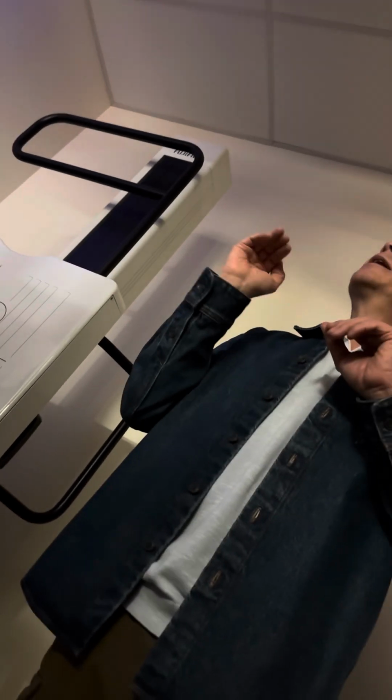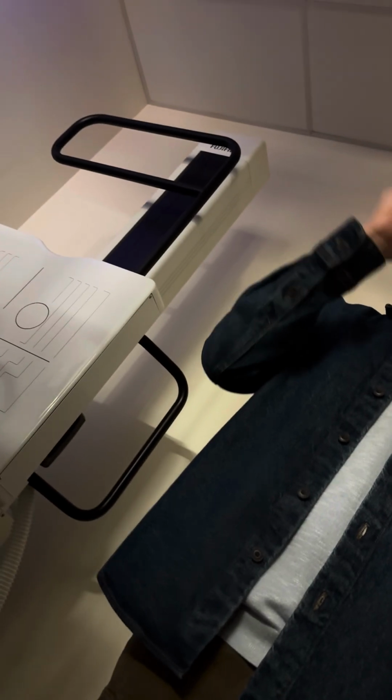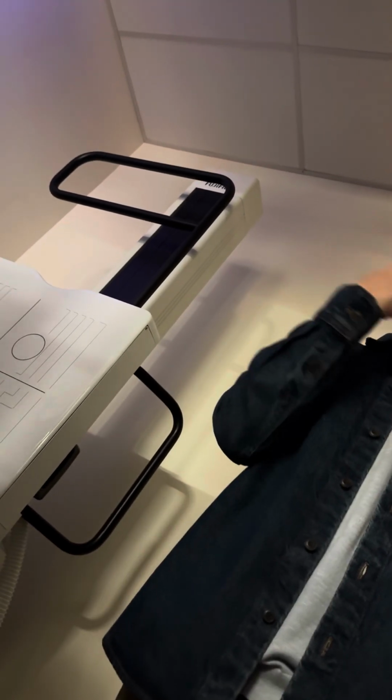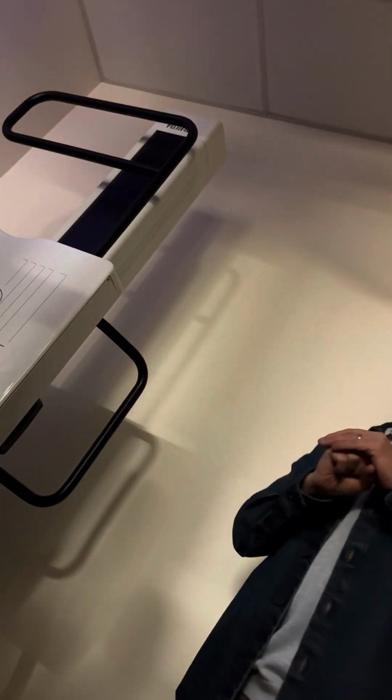And here's my next key to you. When we do the sinuses, we never angle the beam at all because we need to show the fluid levels. Even though the book is saying, oh, we'll do these angulations, never happens. If you change an angulation and you're looking at fluids, you can't measure the fluids and determine whether or not they are solid or a mass structure associated with it.